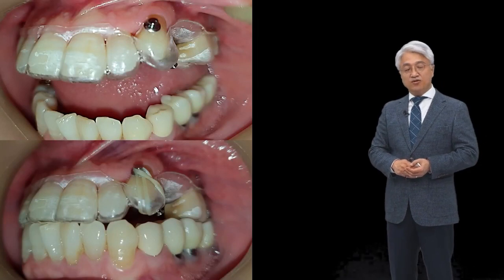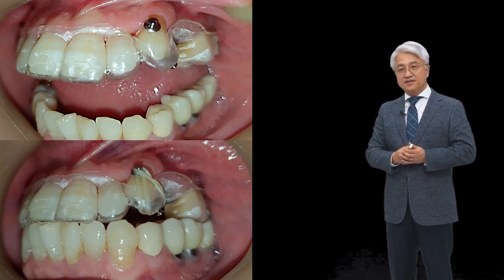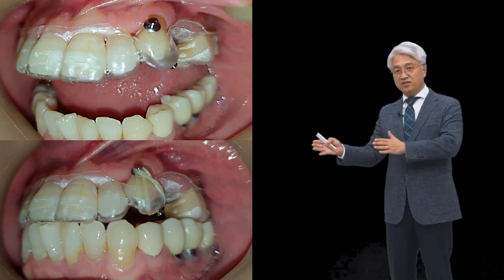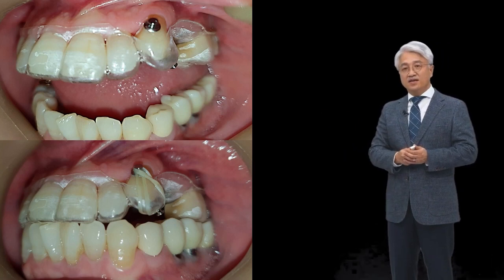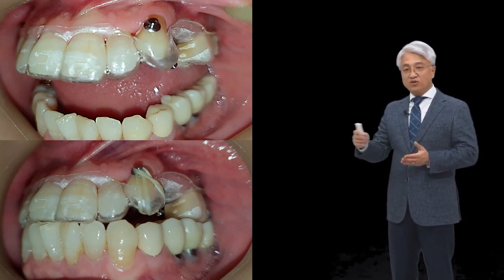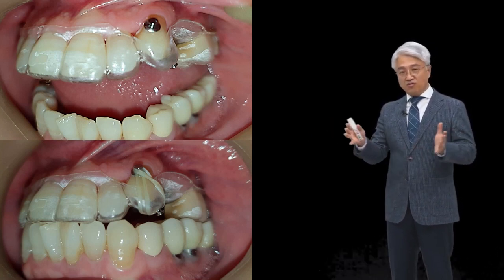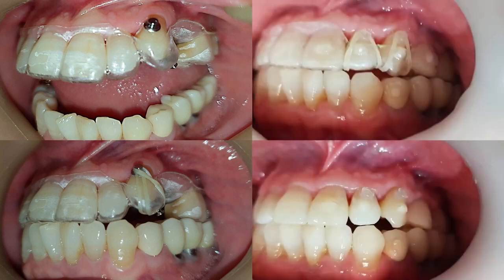In patient cases, when we treated patients in the past, we had to send a lot of patient data to different vendors and do setup, and we had to have approval process after feedback. These processes were quite tedious, and the cost of treatment was quite high. Because the process was so complicated and it took a lot of time, it was difficult to provide an easy solution to patients. However, by using 3D printing and clear aligners, the whole entire process has become much more streamlined and effective. Therefore, we can now provide clear aligner solutions to patients like this.